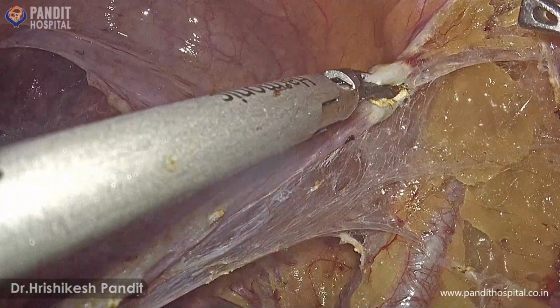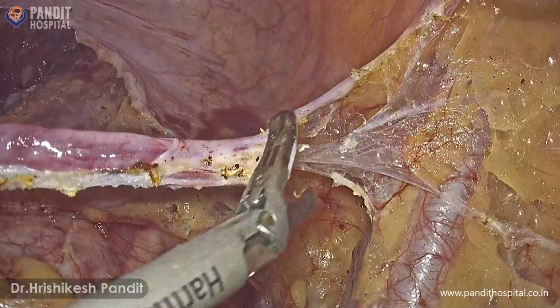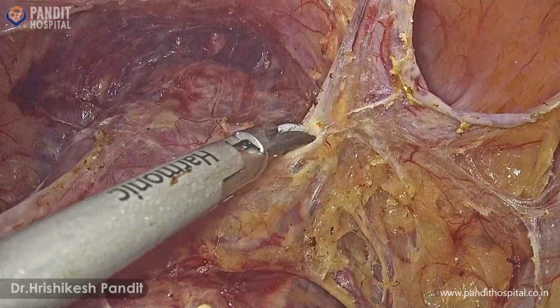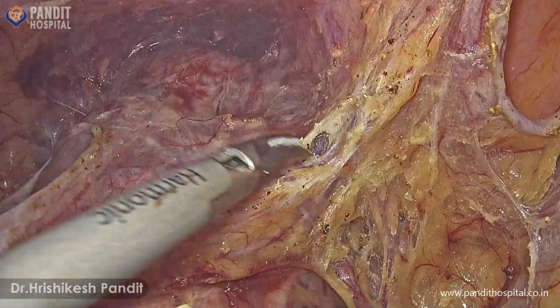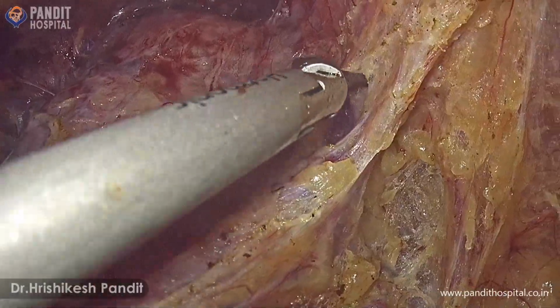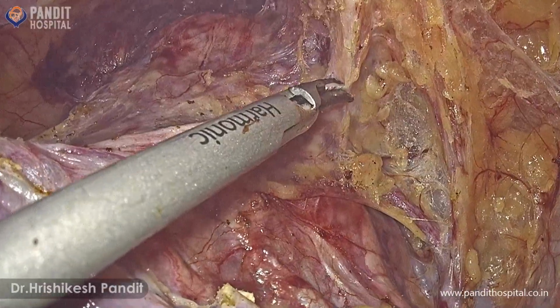Here we are coagulating and cutting the right round ligament close to the lateral pelvic wall. Internal iliac artery continues as the obliterated umbilical artery, which is seen as a streak-like structure which divides the paravesical space into medial and lateral paravesical spaces.